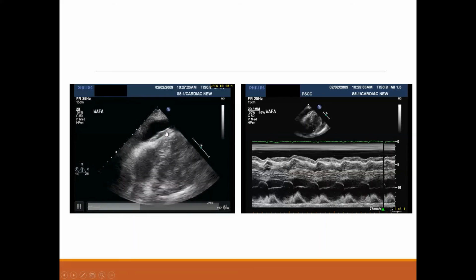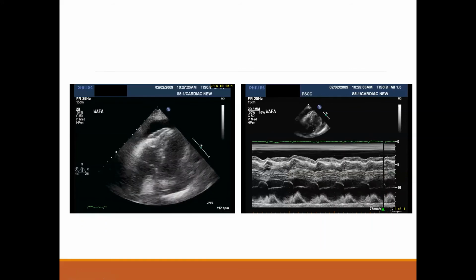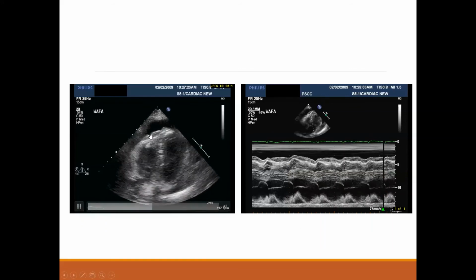By the way, when you see this one, this is fat. So don't be fooled into assuming this is a mass and stuff like that. This is fat, and when you have a fluid, the fat tends to be kind of impregnated with this fluid. It might stick out, it's stouter than it actually is, and it appears like this one. This is epicardial fat, and this is fluid.